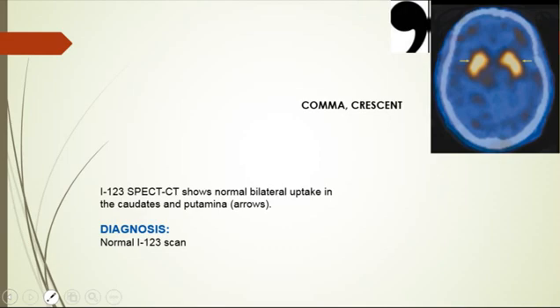Whenever there is movement disorder and dementia in the elderly population, there will be a variety of etiologies. When there is diagnostic uncertainty whether it is a Parkinsonism or other disorders, you should order a baseline SPECT, a single photon emission computed tomography, which can be performed with dopamine transporter, iodine 123, commercially known as DAT scan, the radioisotope called DAT scan.